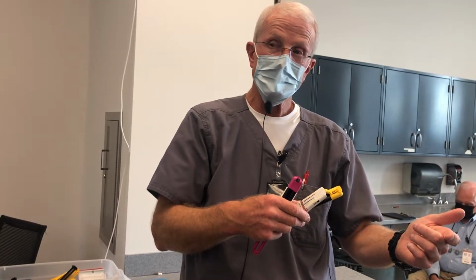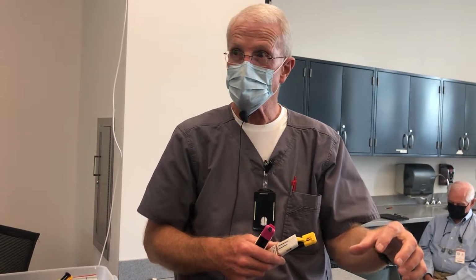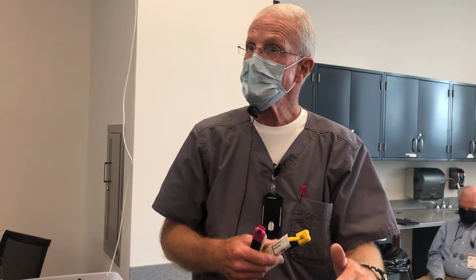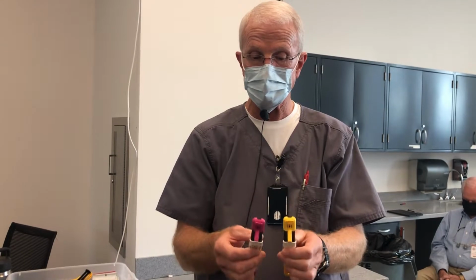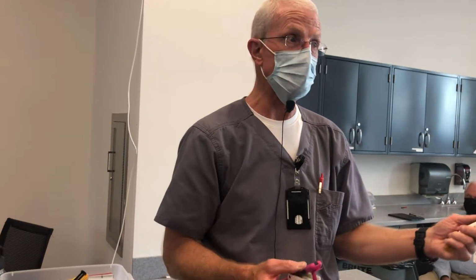Now, you can use RelyX Unicem, which is a self-adhesive resin cement. So it's all resin. It's self-adhesive because, remember, the phosphoric acid is built into the resin. When you mix it and put it onto the tooth, it's actually etching the dentin and enamel, if there's any enamel left, during the first 30 to 40 seconds. Then as the reaction takes place and it polymerizes, it neutralizes the phosphoric acid, so it doesn't linger with the acidity. Both of these work very nicely, and both are quite low in solubility. If you had to choose between the two in terms of solubility, the RelyX Unicem, being totally resin, is the least soluble.